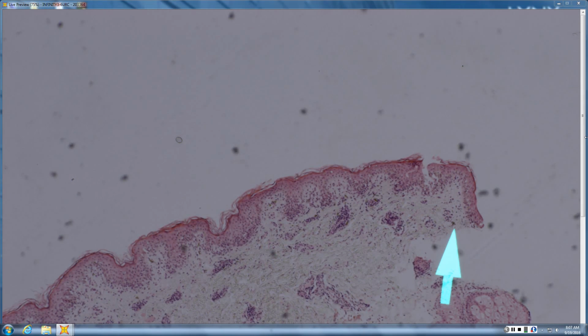What are you thinking? Fixed drug. And you nailed that from scan without even seeing the EOs. That slide is dead, unfortunately.